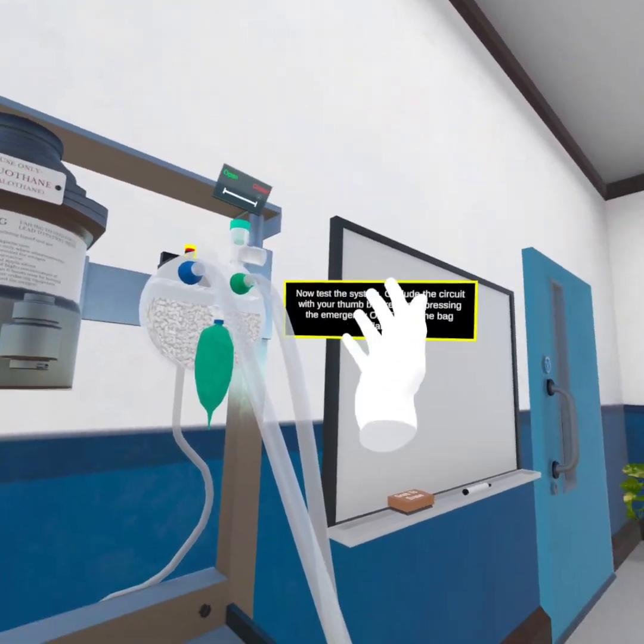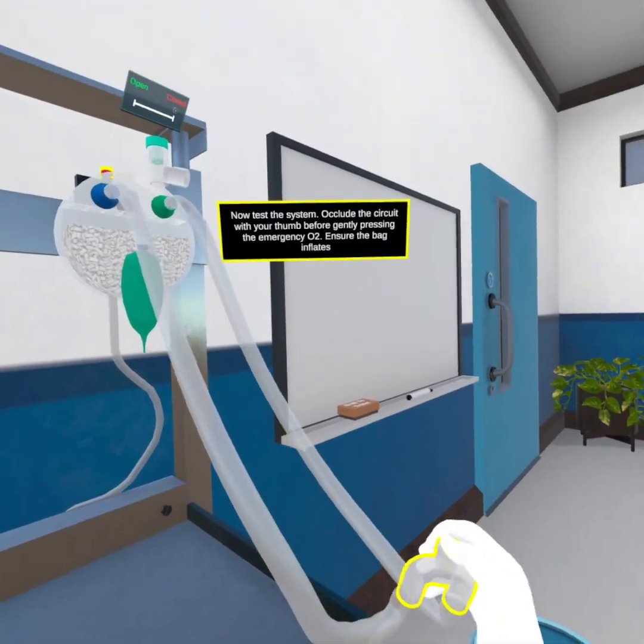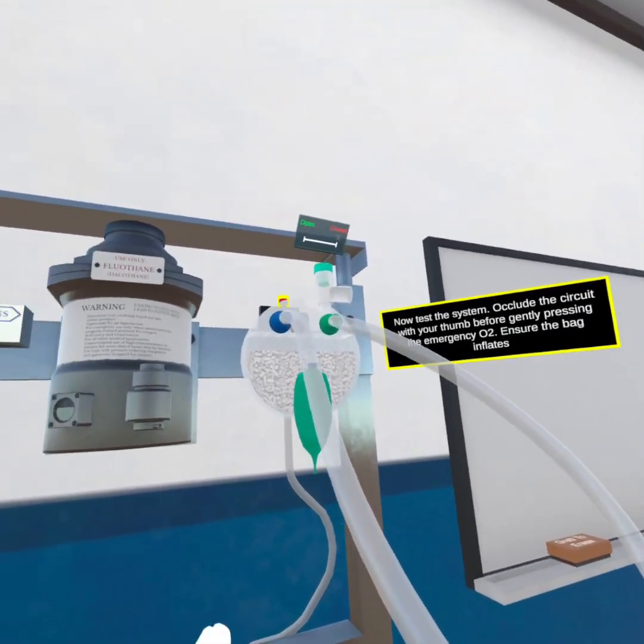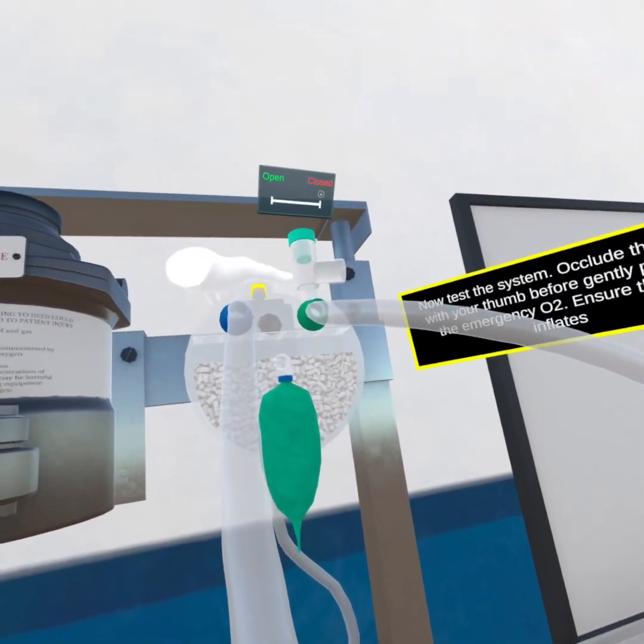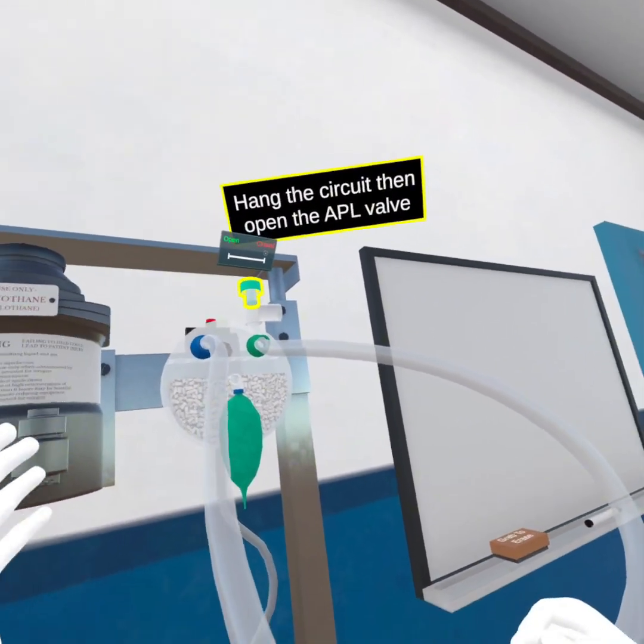Now test the system. Occlude the circuit with your thumb before gently pressing the emergency O2. Ensure the bag inflates. Hang the circuit, then open the APL valve.